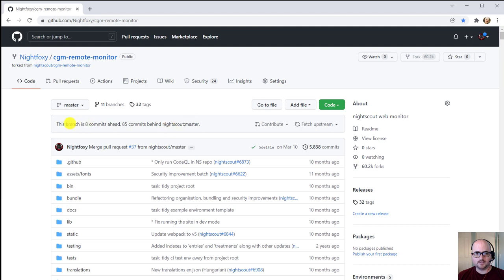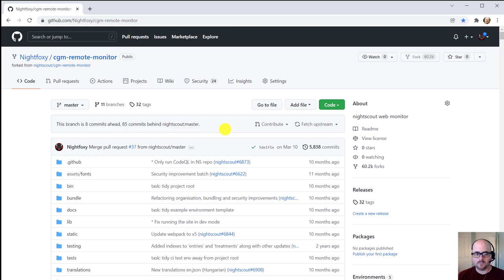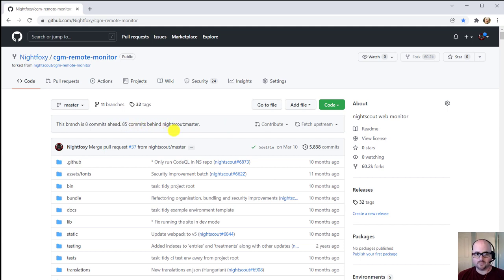So here we can see that the master branch is the one we're on, which is the one we typically use. It says this branch is eight commits ahead and 85 commits behind NightScout master. That means there's some differences between the copy you have and the official copy.